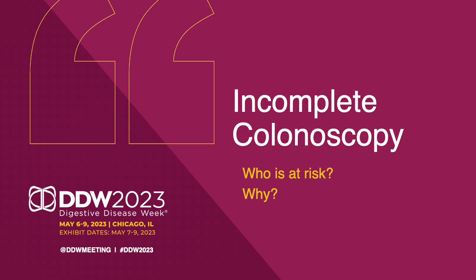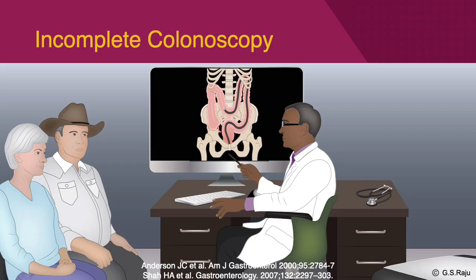Let us talk about incomplete colonoscopy. Who is at risk and why does it happen? When you see a patient who is tall, thin, and a woman, and if she has any history of pelvic surgery or history of diverticulosis with diverticulitis, that patient is at risk for incomplete colonoscopy.